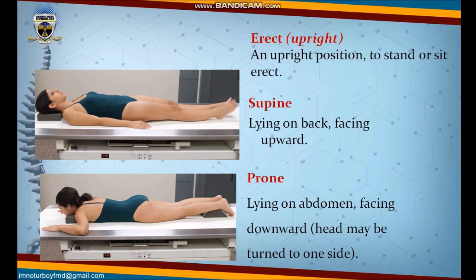Okay, so no illustration is provided for this positioning or general body position. So when you stand up, when you're in the upright position, you can stand in an erect position, and when you sit down, you can also sit down in an erect position.